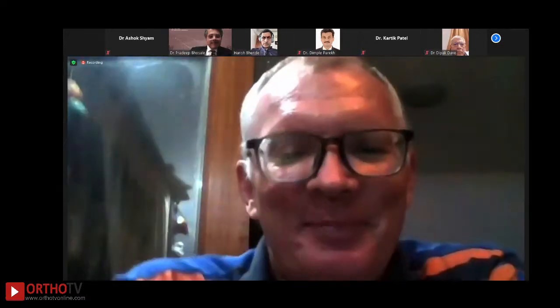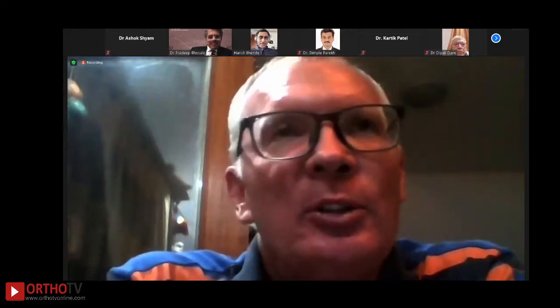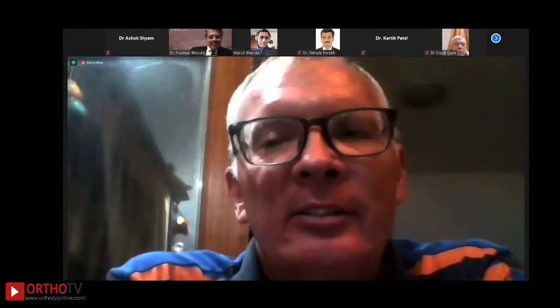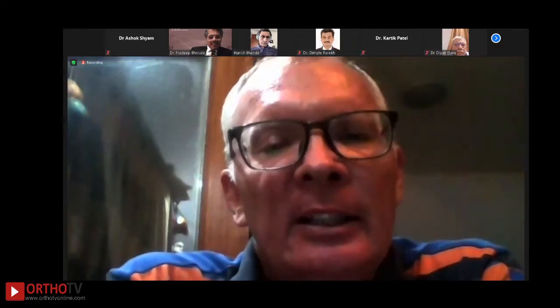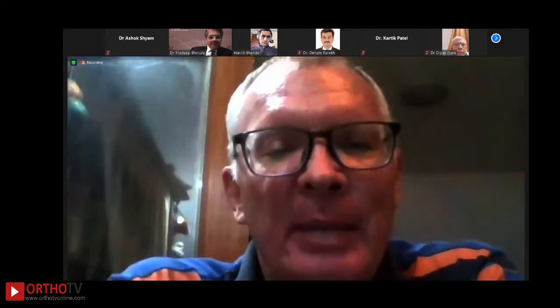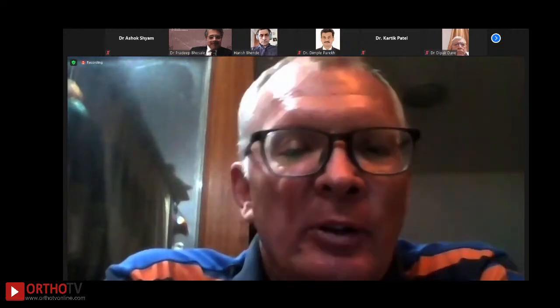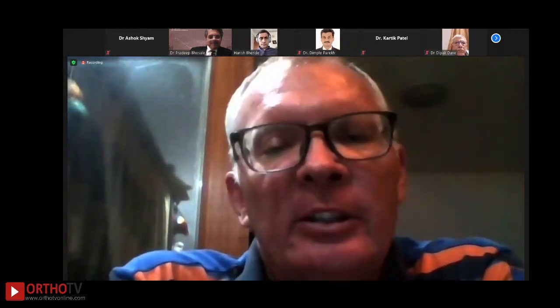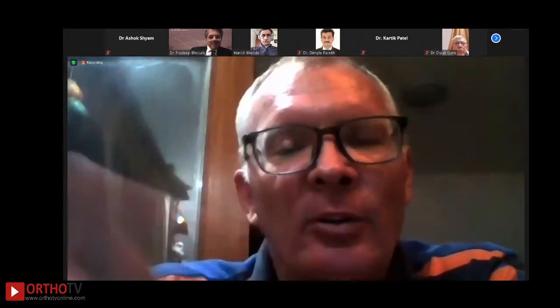Hello, Dr. Bende. Hi, how are you? Fine. Yes, it is compatible. That's the good news. The sleeve is made of titanium vanadium alloy. Even though you have a different material between the cobalt chrome and the titanium sleeve, it's not an issue from the corrosion point of view, the galvanic corrosion, because it's very low.